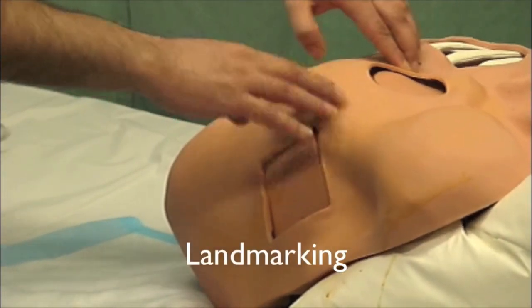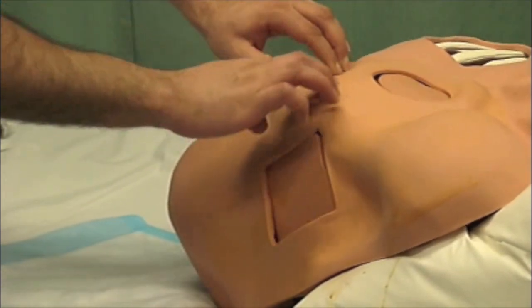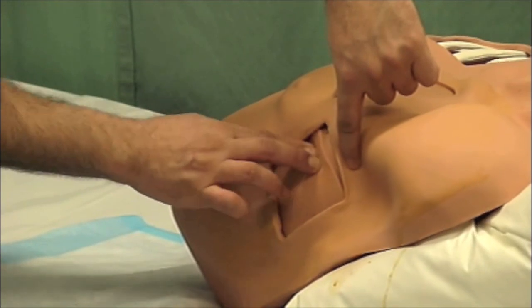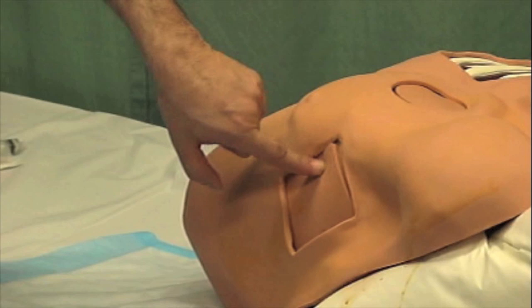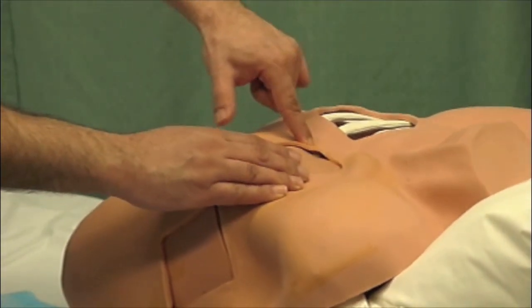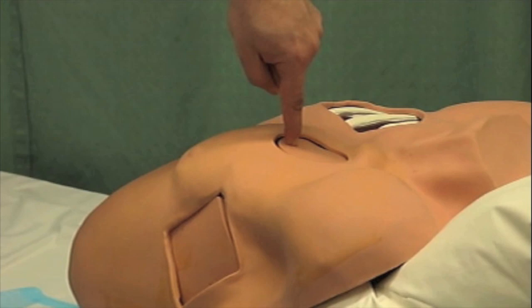There are two acceptable insertion sites. The first is at the fourth or fifth intercostal space between the mid and anterior axillary lines. Care should be taken to avoid insertion through breast tissue; if necessary, retract breast tissue with tape. The alternative insertion site is the second intercostal space at the mid-clavicular line.